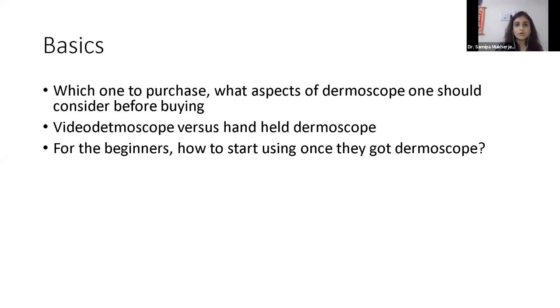Second thing, if you are initiating dermoscopy in the times of COVID, it's mostly going to be contact dermoscopy, and that poses a risk. So what I have started doing is wrapping my dermoscope completely in cling film so that I can discard it after every patient. So that's one tip that I am using.